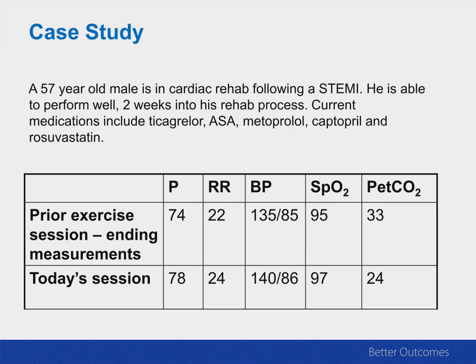So prior to today, heart rate 74, respiratory rate 22, that's a little up. But his end tidal of 33, again, tells us that his cardiac output is probably fine. Now, today, take a look at his session. And what would bother you about this patient?